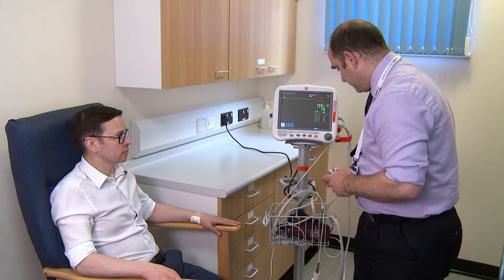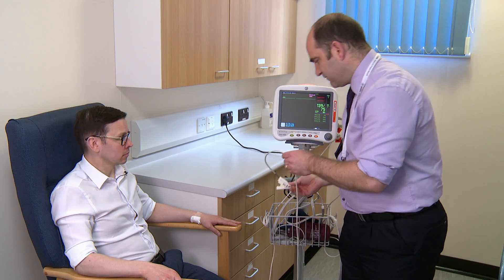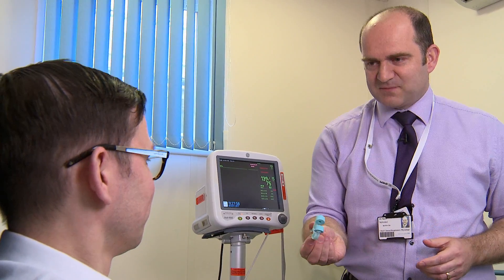So first thing I'm going to do is pop an oxygen saturation monitor on your finger so that I can measure the oxygen levels while you're conducting the test. If I can pop that on a finger, we'll just make sure we're getting a good signal. Okay, so here's some nose pegs for you to wear. If you want to pop those onto your nose for me, please.